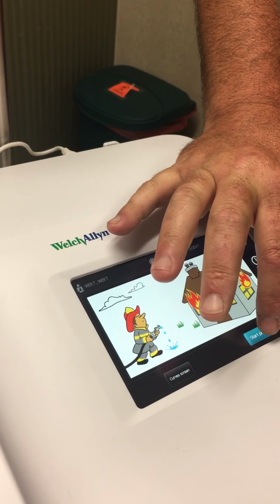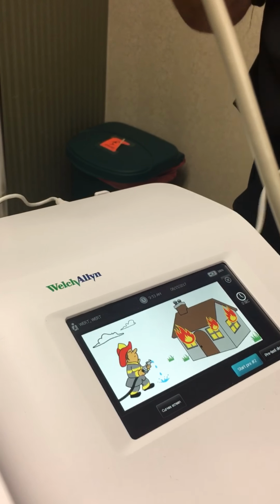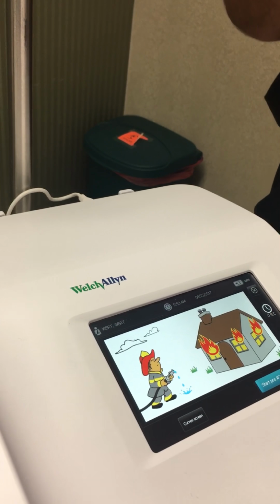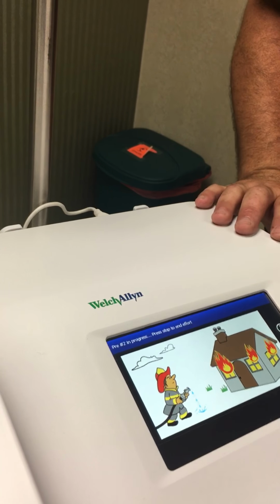I'm going to start test 2. Now this is not a race, okay? But you also don't want to have the patient in here for 3 hours. So have them take a couple of deep breaths, get comfortable, then do the next one. So we're going to hit start test. Test 2.